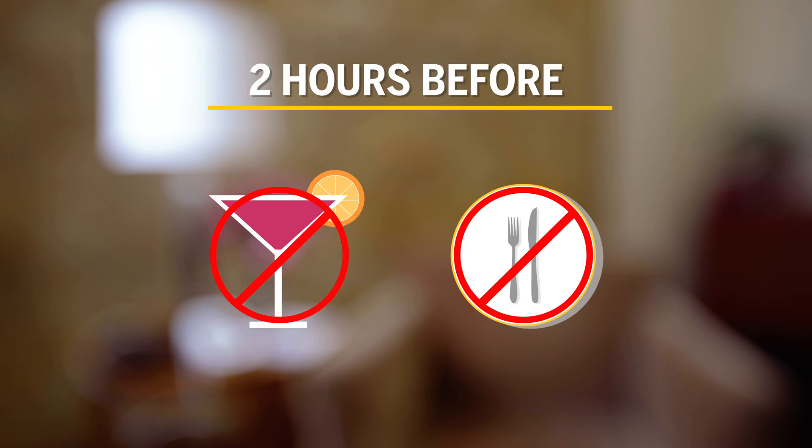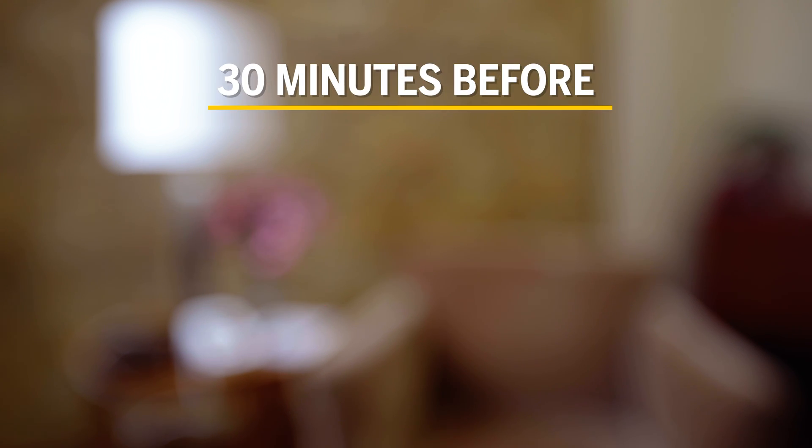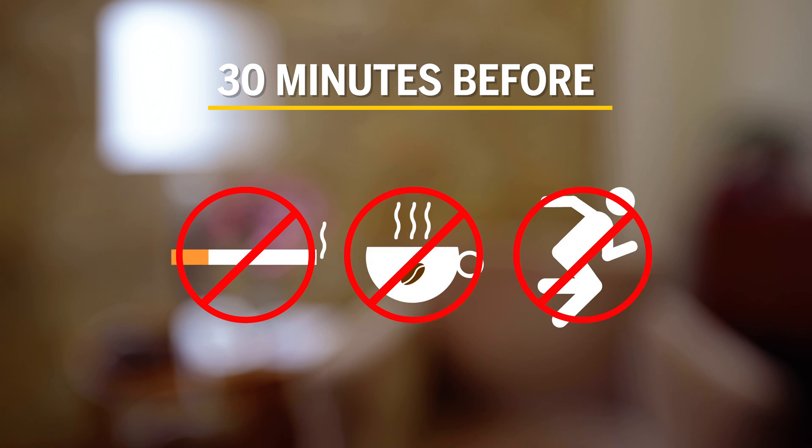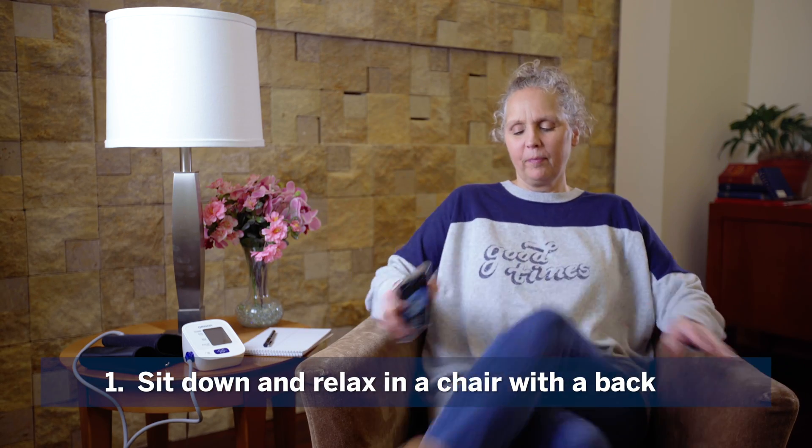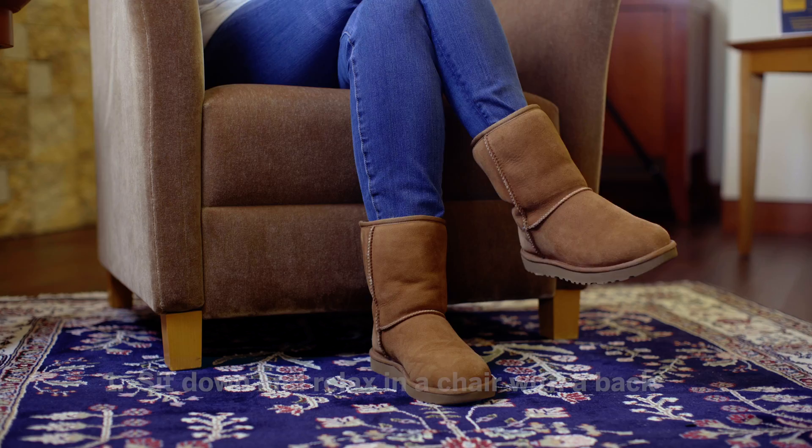Here's how to take your blood pressure at home. Before you begin: two hours before, no alcohol or eating; 30 minutes before, no tobacco, caffeine, or exercise.